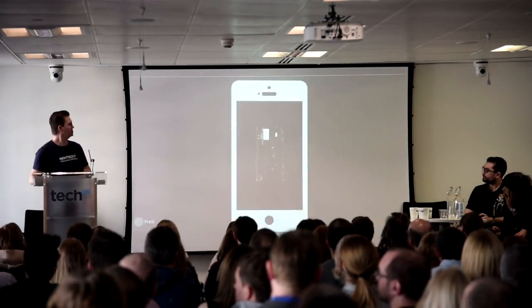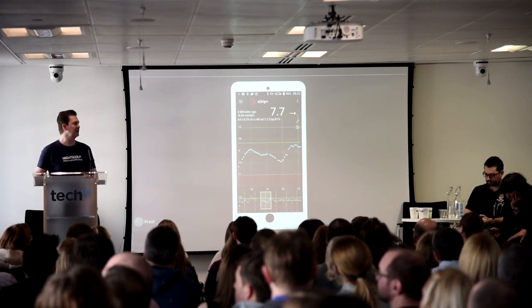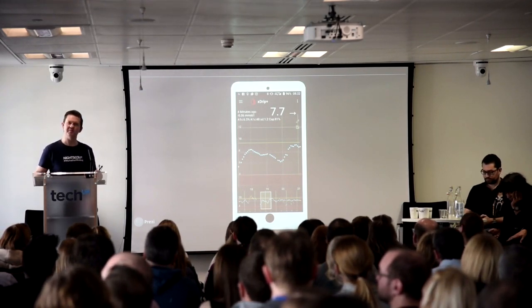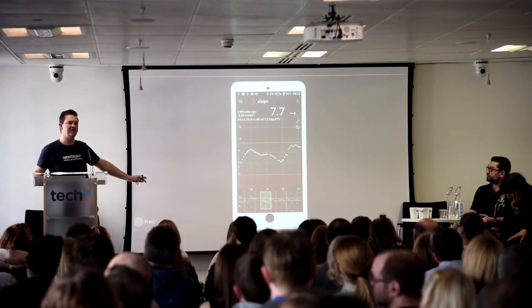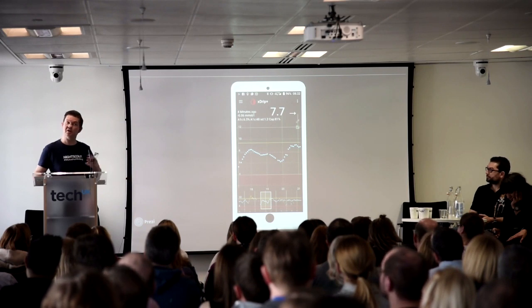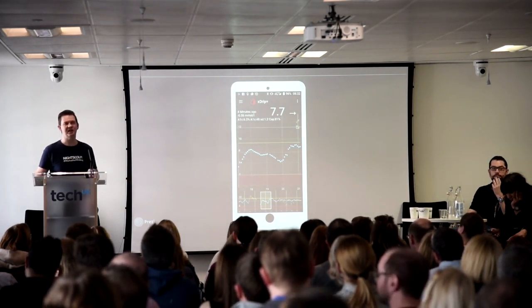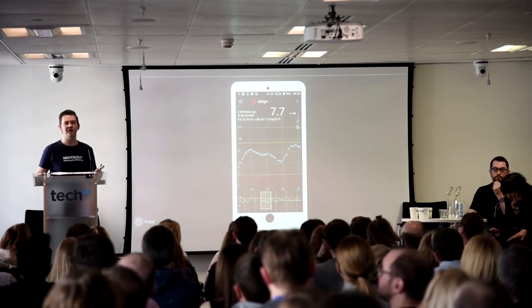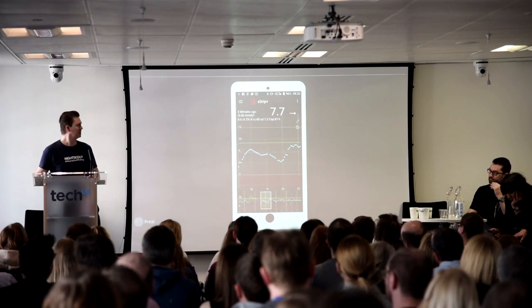So it's good to see it on the website, much better to see it on the phone. And this is where the interesting part of all Nightscout was about getting CGM in the cloud. To run this extra app on the phone, you don't actually need any cloud-based stuff at all. So a lot of adults now, I see a few of you in the audience that are already using xDrip to get information to your own phone as an adult, as opposed to having anybody looking at it from afar.